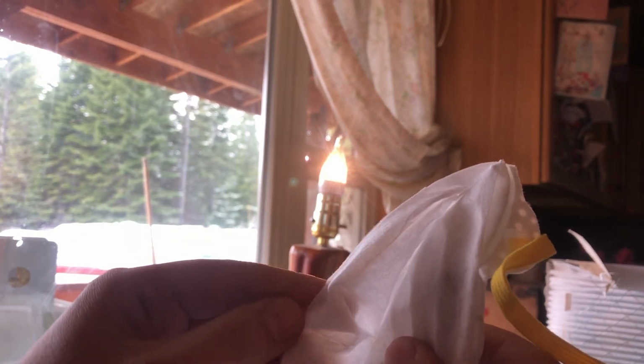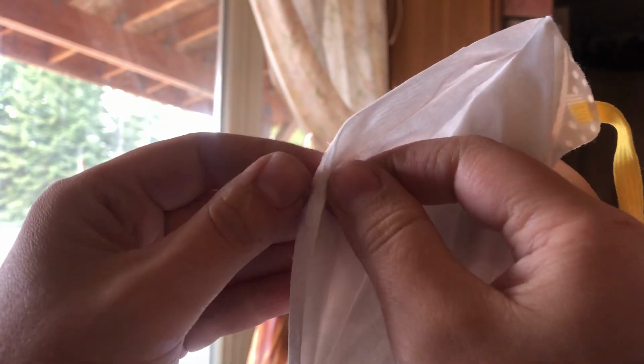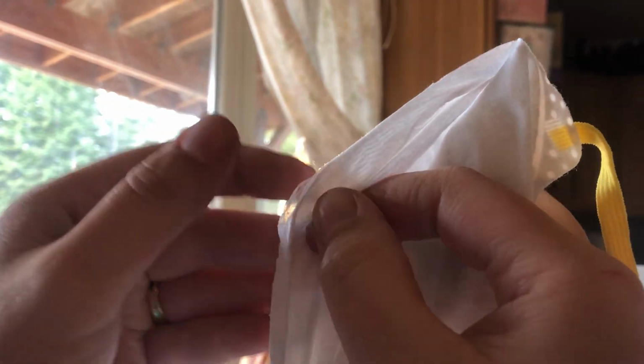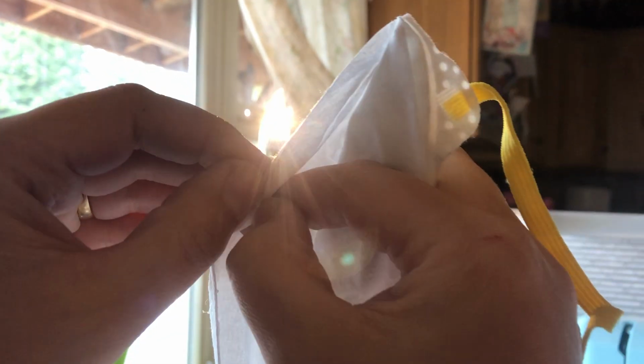Now we've got something in the middle here that looks probably like the thing that's doing most of the work. We've got two layers of this. It's really soft, it's really flexible. I put water on this. It holds up to the water just fine. It just kind of runs off of it.